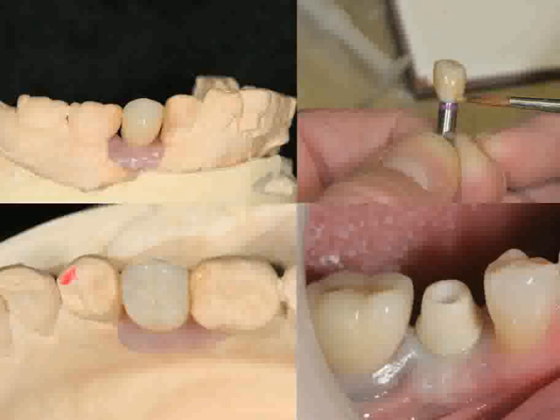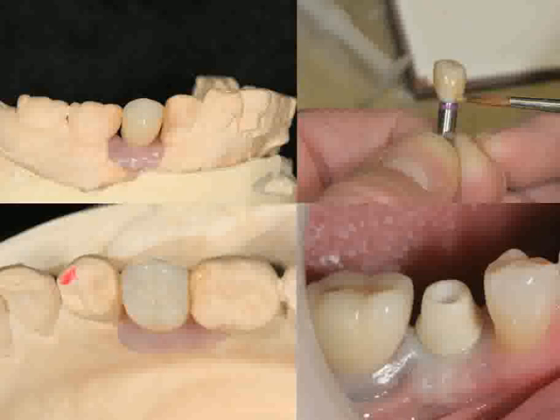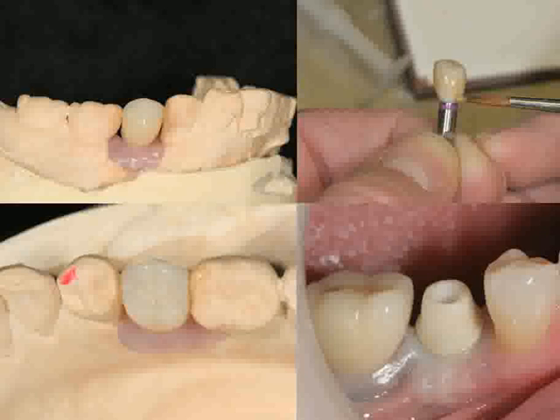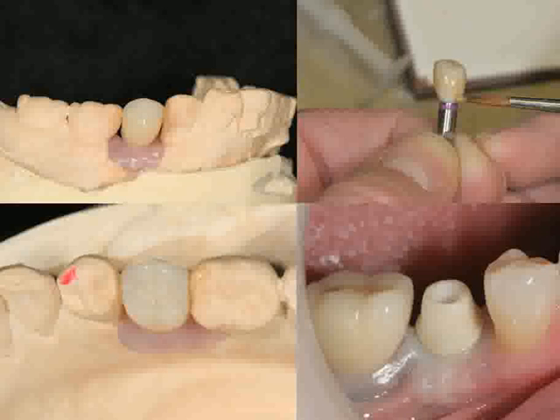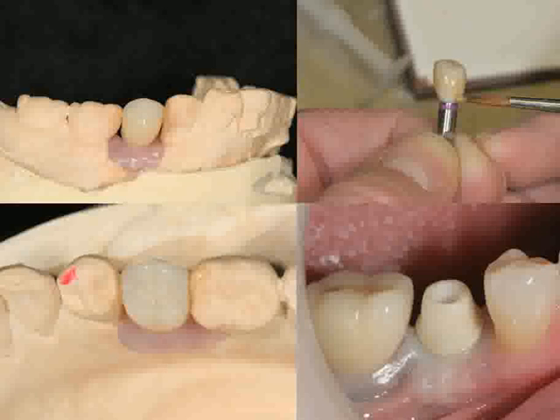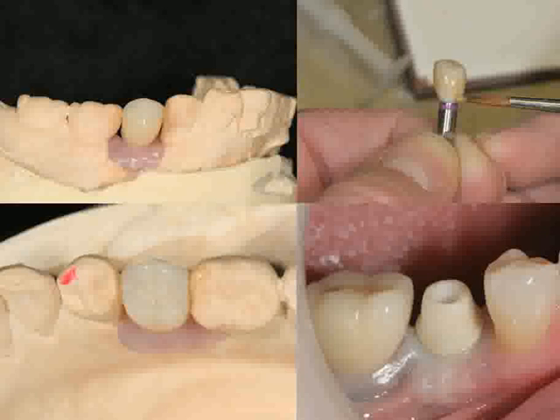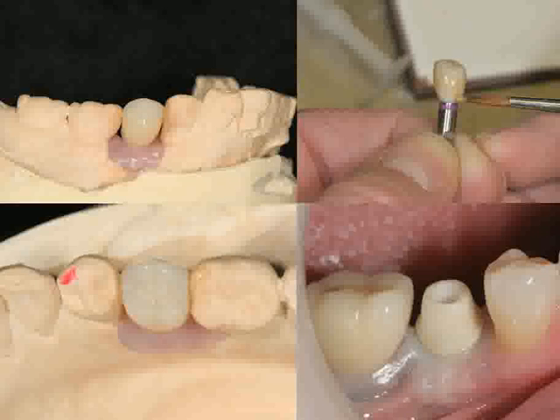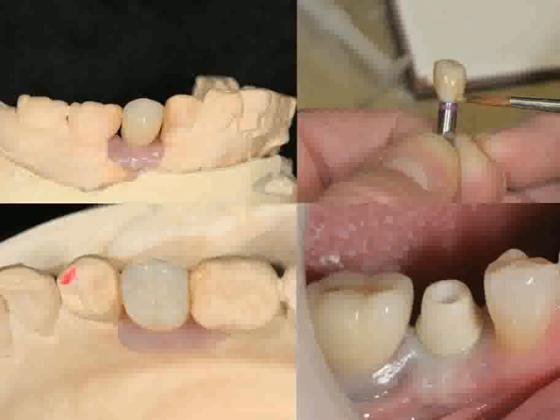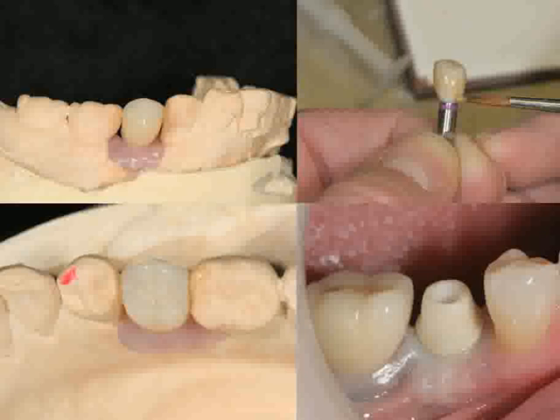Sometimes it's important to talk about the elephant in the room. So many people ask us: is Emax strong enough to be an abutment solution? This particular case we did with Ivoclar about seven years ago. Before we had the ability to do this fully chair-side, this was a hybrid case imaged and then sent to ceramists at Ivoclar. What you see is an Emax crown — in the top right — and we're staining the actual abutment portion to shade it to look just like the crown. The lower portion shows an occlusal view on the model and a clinical shot of that Emax abutment in place. We have had Emax in the mouth as an abutment solution for quite some time.